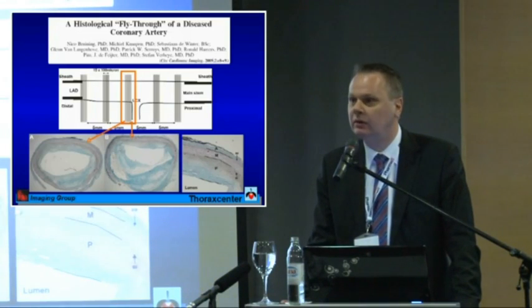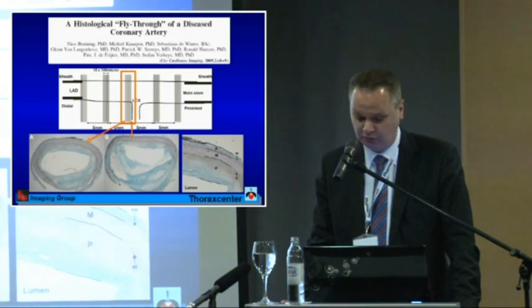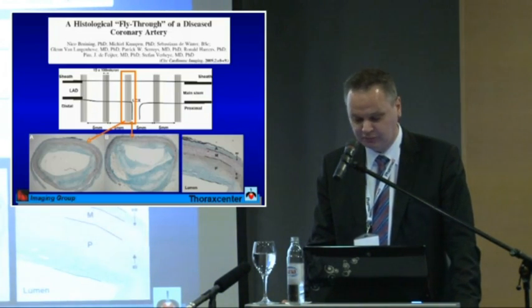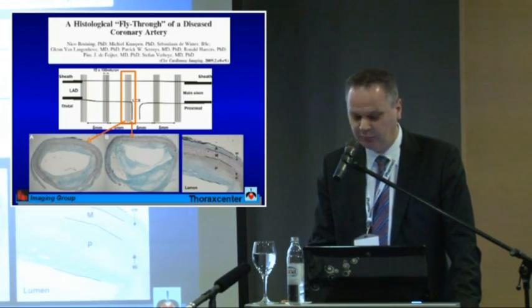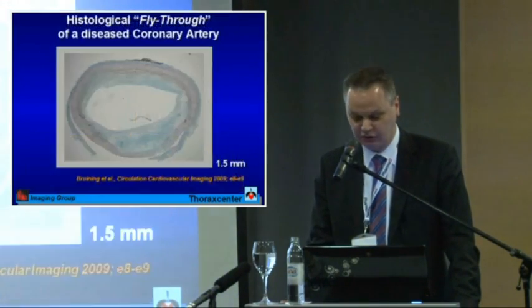These slides are stained with trichrome staining, and everything that is green is fibrotic tissue, everything that is whitish is necrotic and calcified tissue, everything here in the P, that is the intima and the plaque, purple are smooth muscle cells that are surrounding the vessel, and then the outer layer of the vessel is the adventitia, which is also fibrotic tissue.